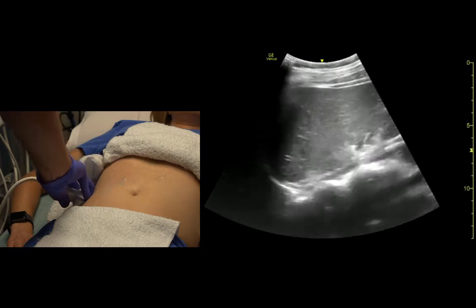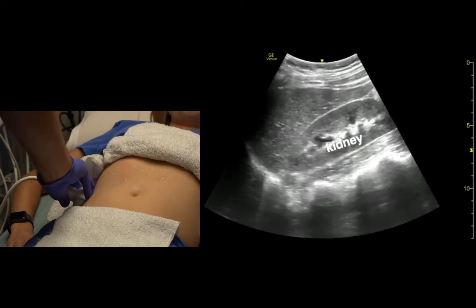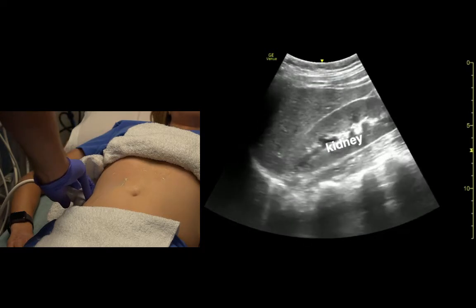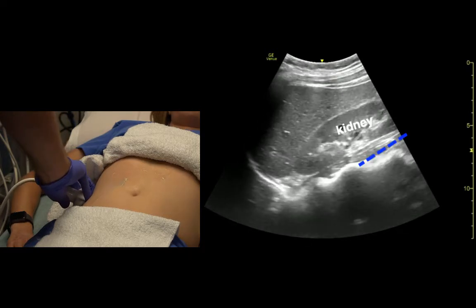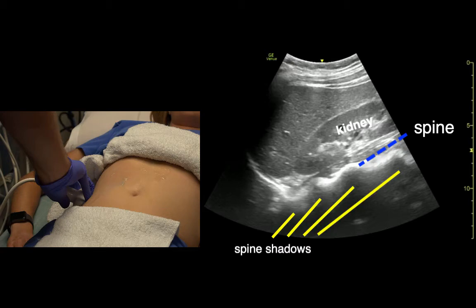If we fan posteriorly here, we can see the kidney and the spine.